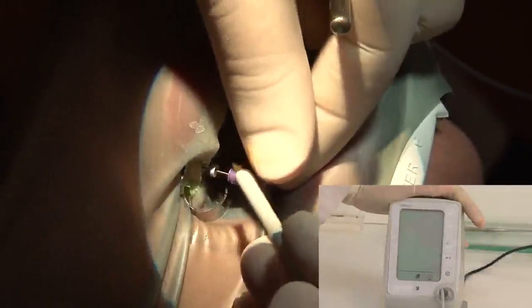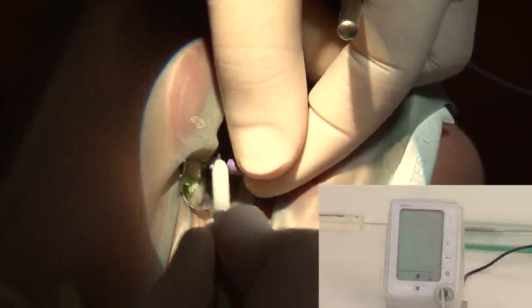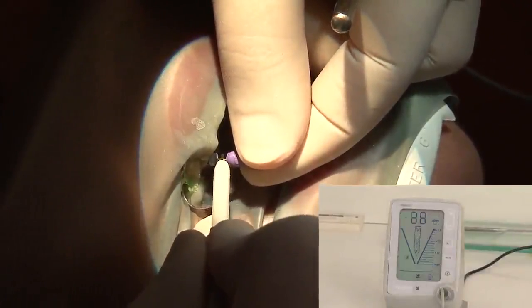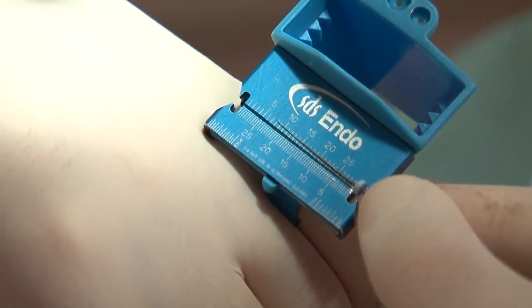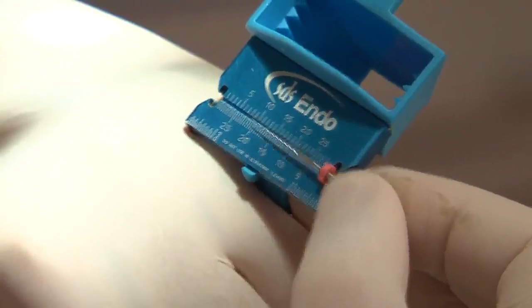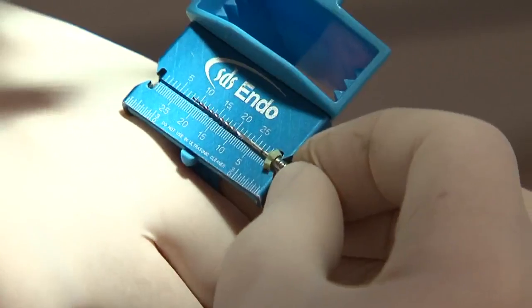The next step is establishing the working lengths with the element diagnostic unit. A size K10 or K15 file is used. Once we touch the file, the element will be activated. We need to go down to minus 0.5 — meaning the file is outside the root canal — then take it out slowly to the zero-zero level, which is our working length reference. Using the palatal cusp as reference, the working length is 22mm for both canals. I adjust my TF5s 25-06 and 40-04 to 22mm also.